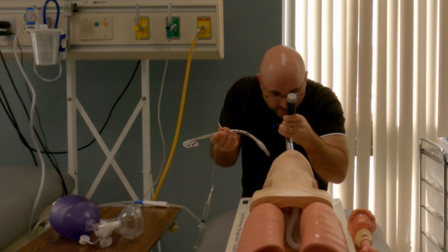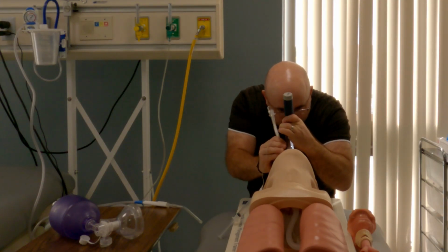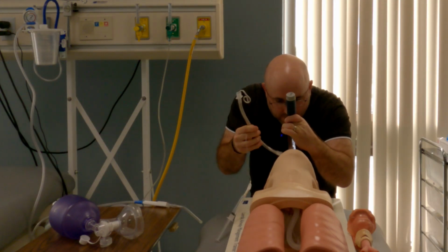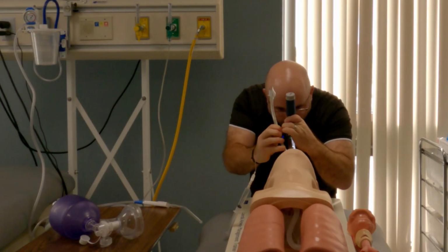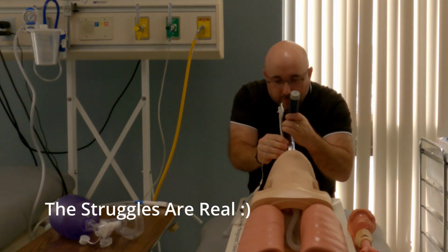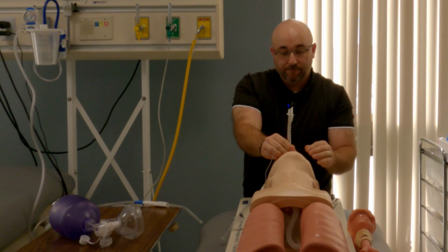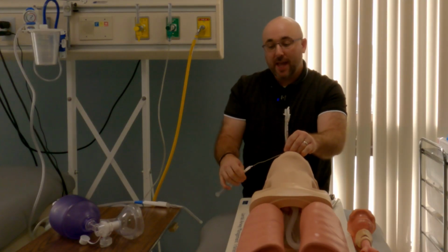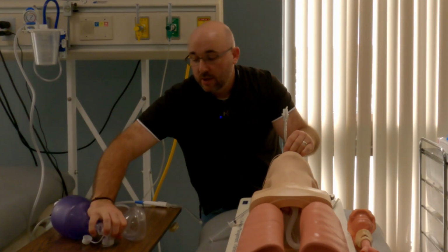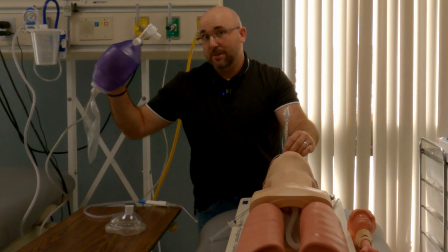We're going to find the glottis again because I had to look away for intubation. And we're going to intubate this patient. And this one, okay, excellent. So we're in. At this point, I've secured. While I was doing that, you took the mask off of the bag valve mask. So now we just got bag valve.